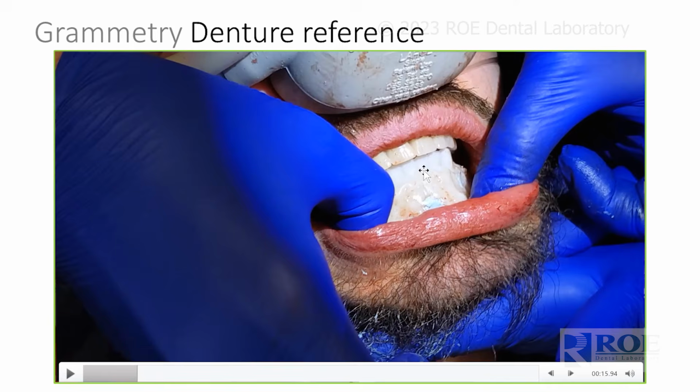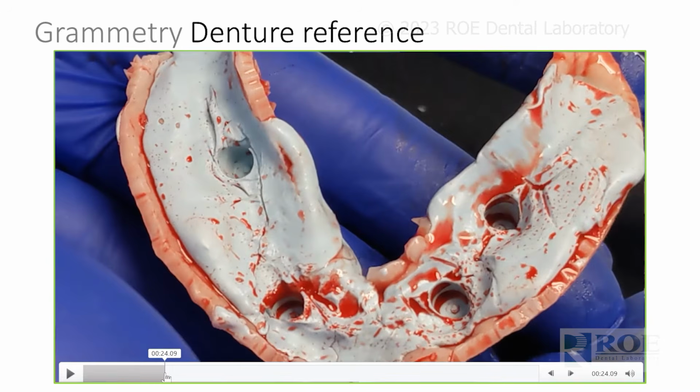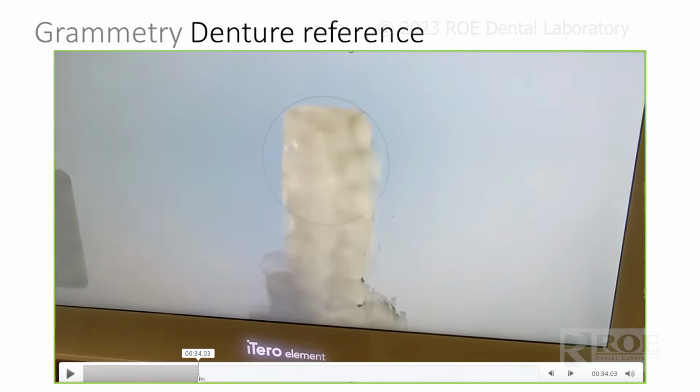Now at this point, the doctor has already tried in the upper denture and lower denture without any material to make sure that they're not hanging up on the scan bodies or on the healing collars because they're kind of tall, right? So you have to grind out the inside of these duplicate dentures or immediate dentures to make sure that they're not wobbling on healing collars. All right, they need to fit just like dentures. So once that is set, okay, they're removed. You scan the prosthetics 360.